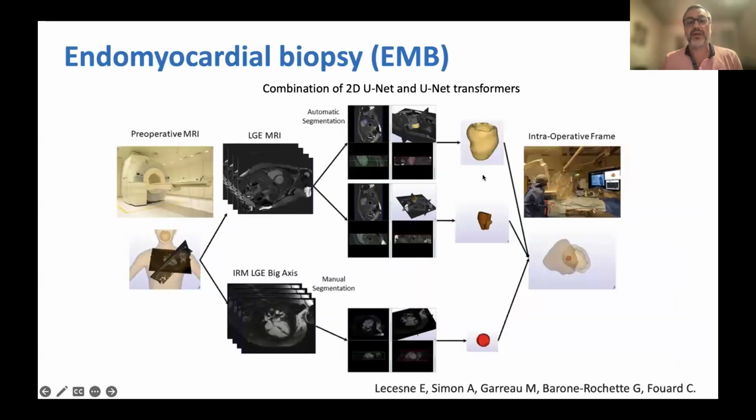Finally, to help the performance of the endomyocardial biopsy, my center, with the collaboration of different laboratories, developed a specific new technique. We used a preoperative CMR with automatic segmentation of the late gadolinium enhancement image, a combination of 2D UNet and UNet transformer, to finally obtain an automatic modelization of the ventricle.